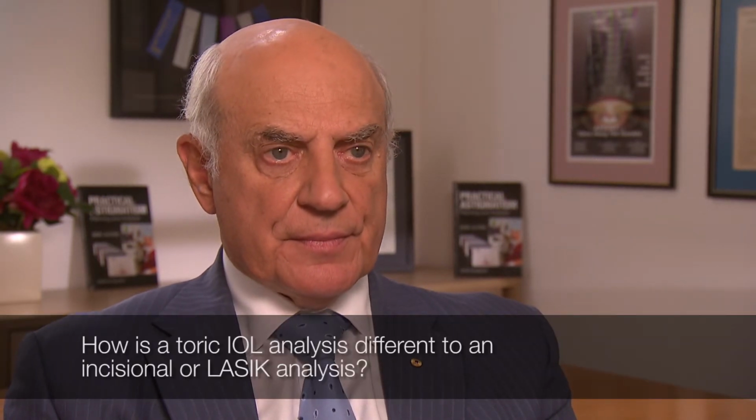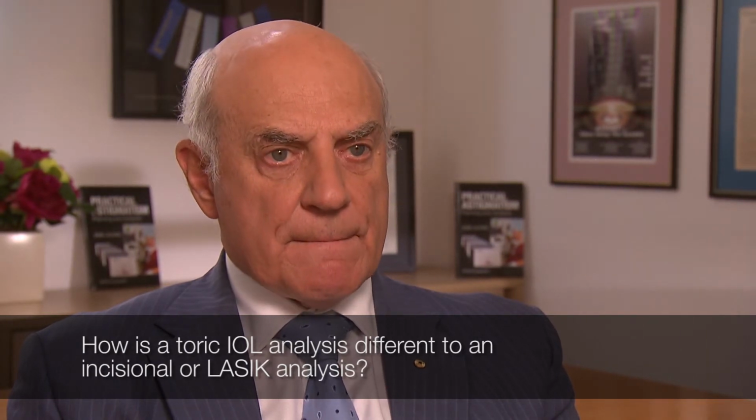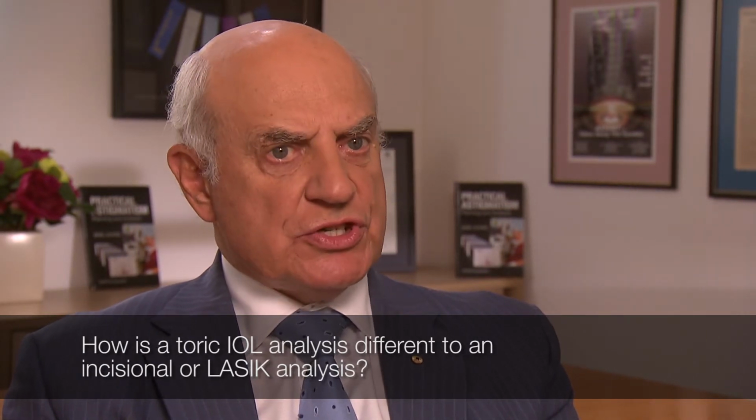How is a toric IOL analysis different to an incisional or LASIK analysis? That's also a good question. So when you do astigmatic analyses, always make the point you want to have the same device to measure before and after measuring the astigmatism, regardless of whether it's a topographer, an aberrometer, or a manifest refraction.